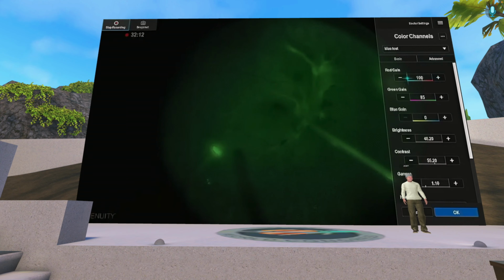So, one thing, Alan, you mentioned the time that the intraoperative fluorescein angio takes from our surgery. When we incorporate this imaging modality, it takes no more than 30 seconds to prepare for the starting of the angio, and then obviously we'll need at least 5 to 8 minutes if we want to constantly monitor the changes during the FFA. Depends on what we want to see.